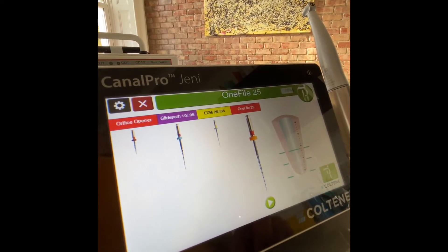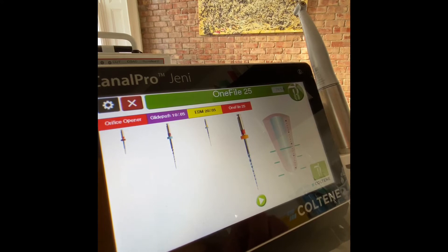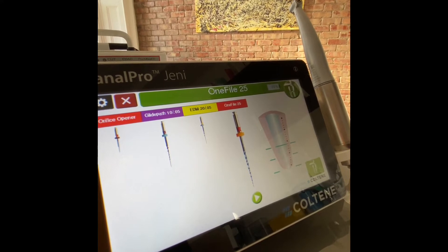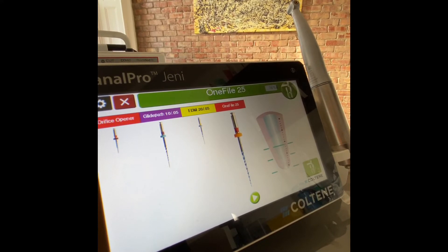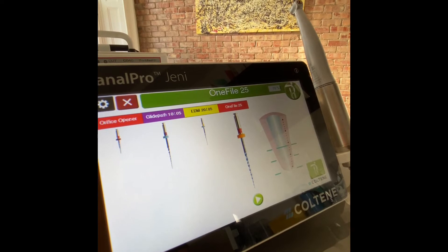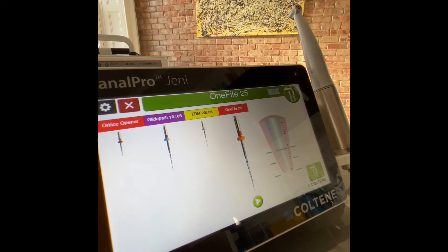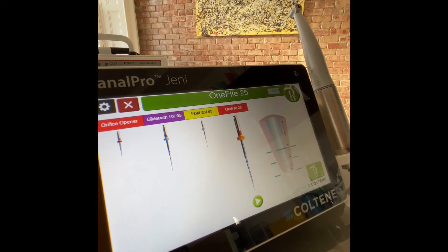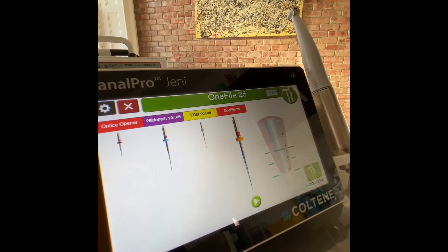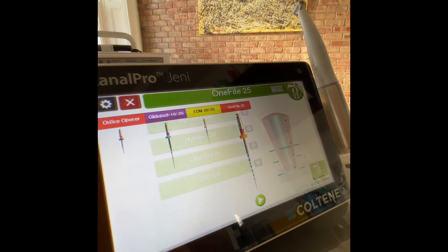Everything can be connected to the apex locator in situ. I would personally recommend that it's a great help, but at the end we should always test our final readings with a stainless steel file where we gauge the foramen and dry the canals. This is because while working with rotary instruments, the pulp chamber should ideally be full of hypochlorite, which creates a discrepancy with the apex locator.